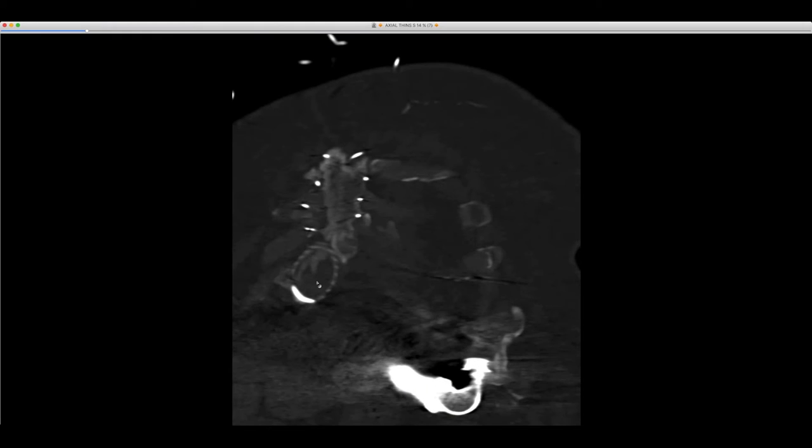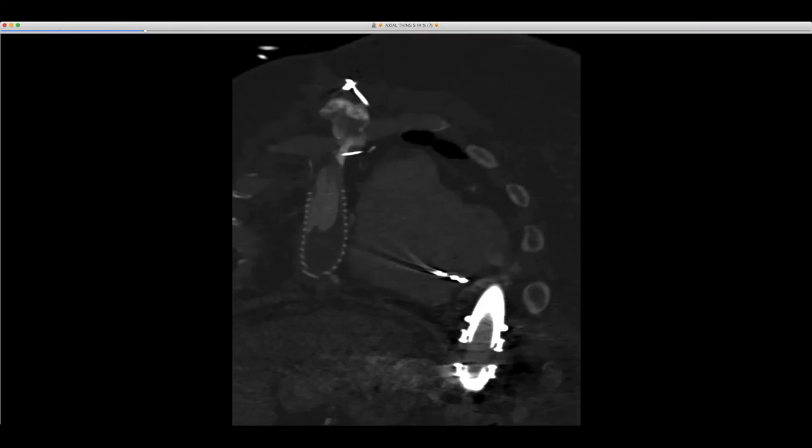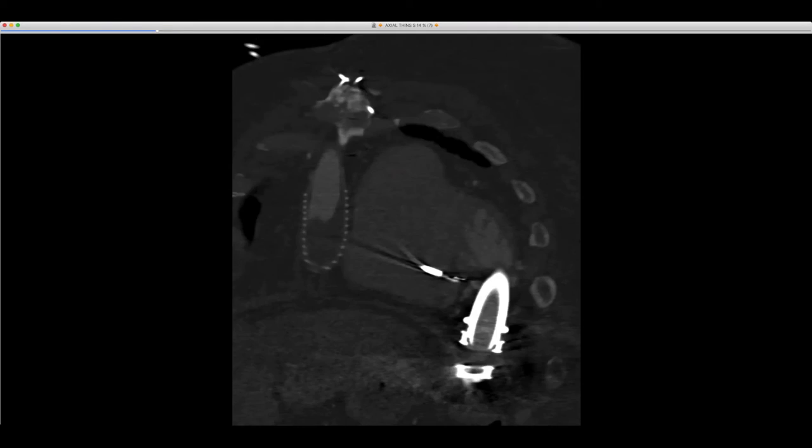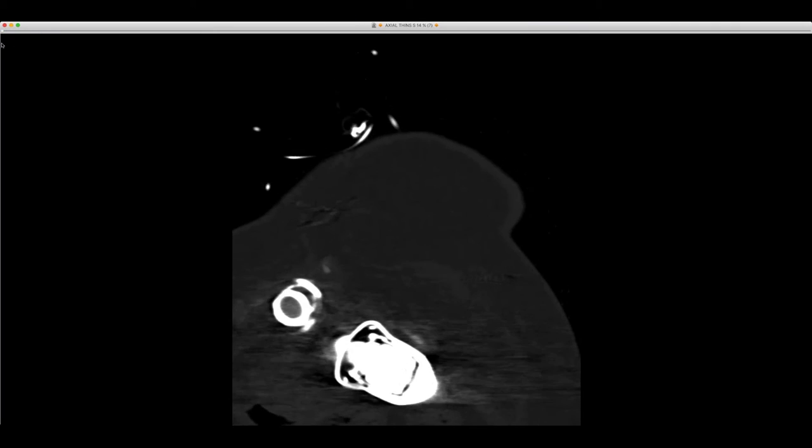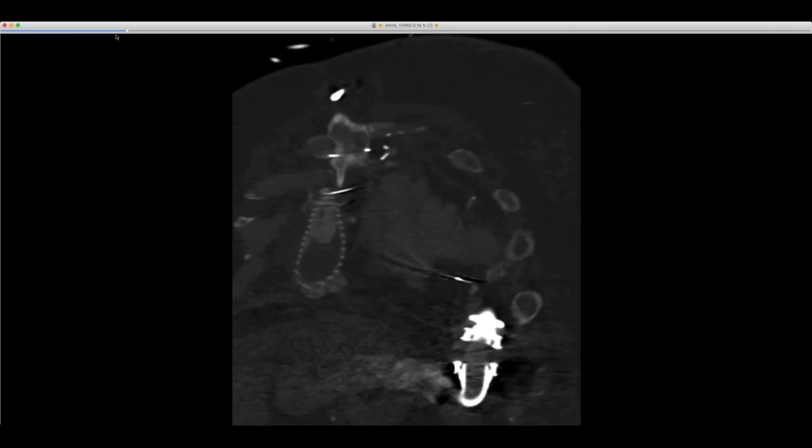And so, due to turbulent flow and just lack of adequate flow through there, you can get thrombus. And why this went into the wrap, we've seen cases of little holes being created in the graft because of this sort of dislodged bend relief. So that could have been responsible for why it looks like most of this is actually in the wrap instead of in the lumen. It's just a good case of a HeartMate 2 dislodged bend relief causing this complication.